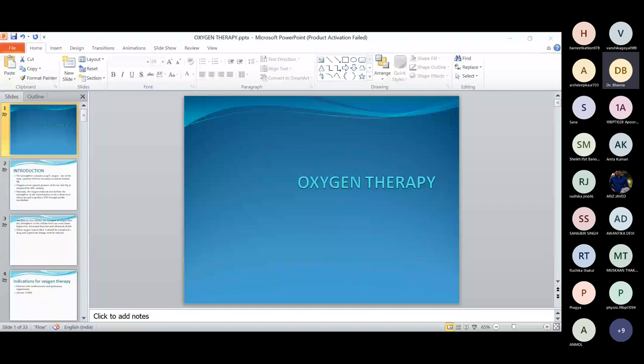At one end you can see the two holes and a loop, this goes in the nose. At the other end, the green open side is connected to the oxygen. Through this pipe, the oxygen is delivered into the nose. All right.